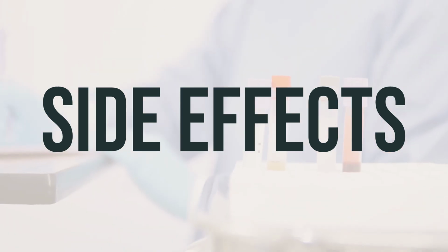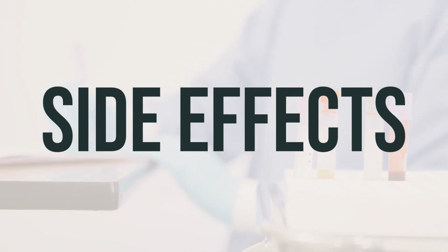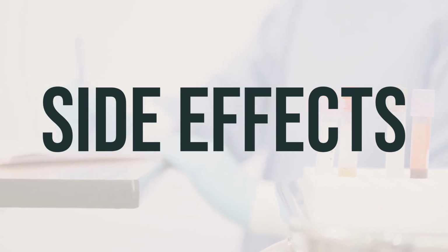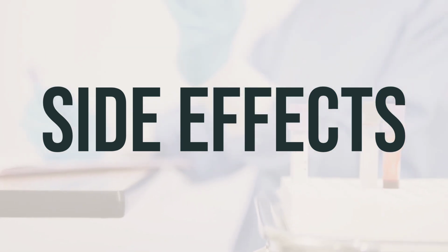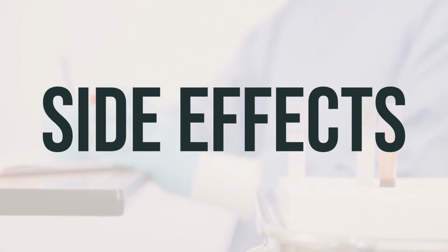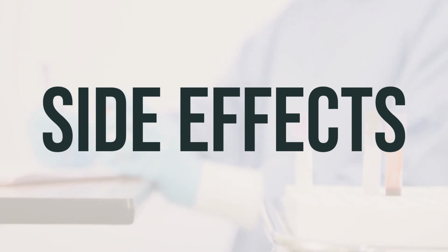Remember, the benefits of using this device outweigh the risk of side effects. Many people using this device do not have serious side effects. However, if you experience stomach/abdominal pain, vomiting, lumps in the breast, mental/mood changes, unusual changes in vaginal bleeding, dark urine, yellowing eyes/skin, unusual headaches, or symptoms of a serious allergic reaction, seek medical help right away.